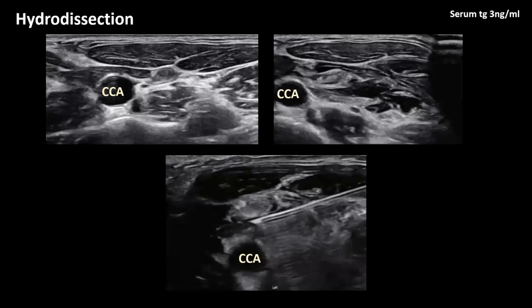Serum thyroglobulin was slightly increased in this patient. A small recurrence was found at her lateral neck on ultrasound. After hydrodissection, the lesion was separated from the surrounding structures by cold 5% DW. I'll play a hydrodissection clip for you.